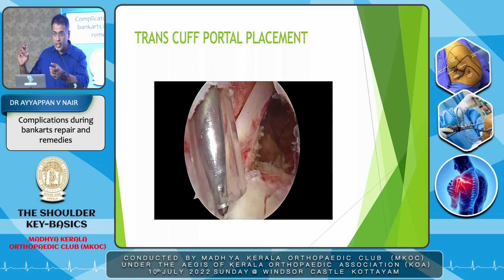So open it and close it again 2-3 times. When the fluid starts running, it goes off. So that is one important thing which I have identified.